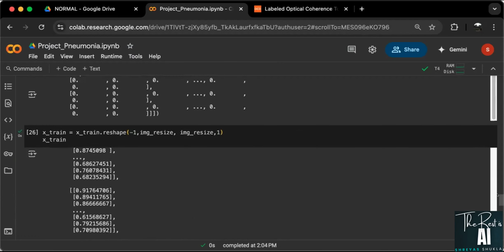When we put that in X train, it is going to reshape it into this dimension over here.